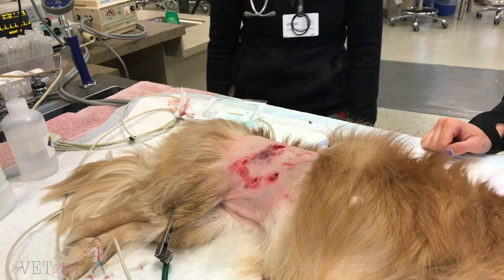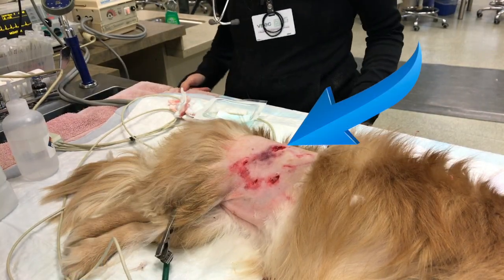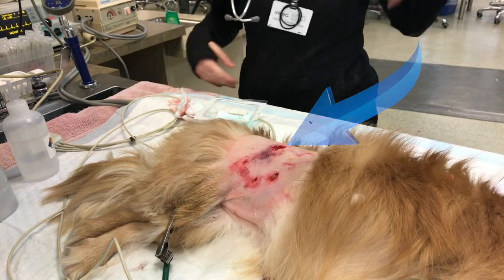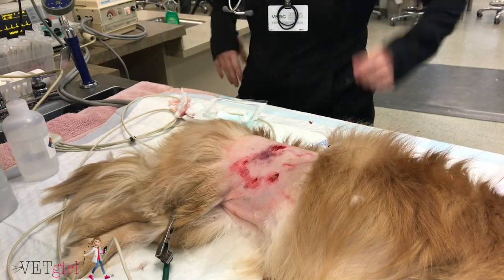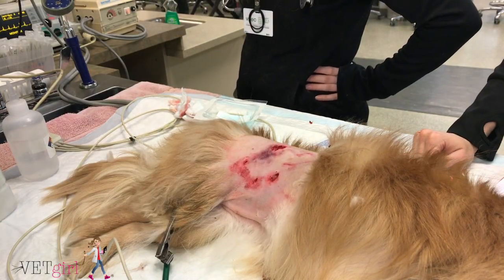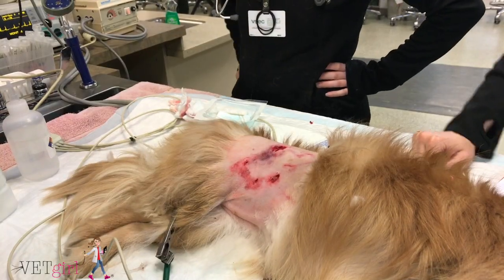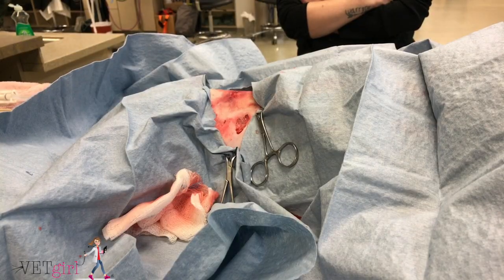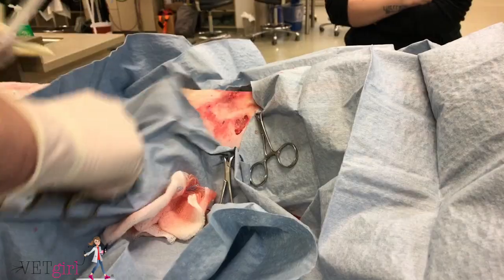To place the drain, the most dorsal aspect of the dead space pocket is chosen to tack the drain. The proximal end of the drain is blindly tacked underneath the skin with a non-absorbable suture such as Ethylon, either 2-0 or 3-0 in many cases.